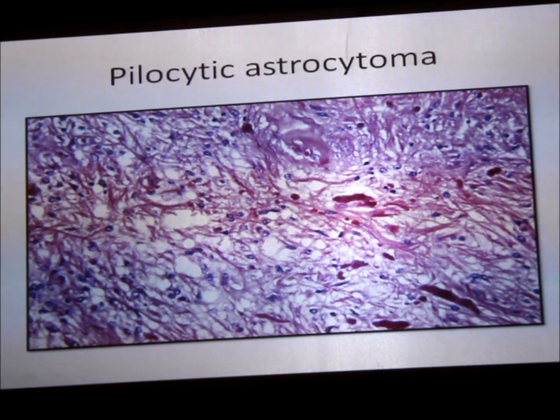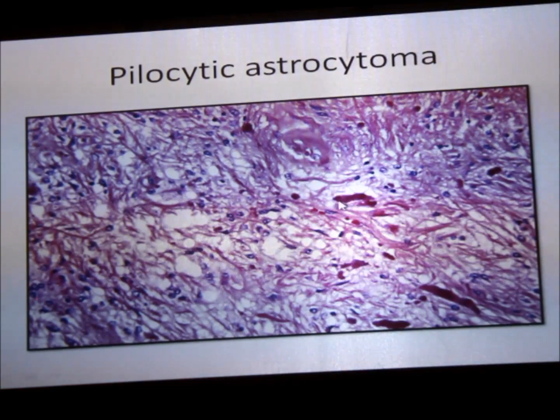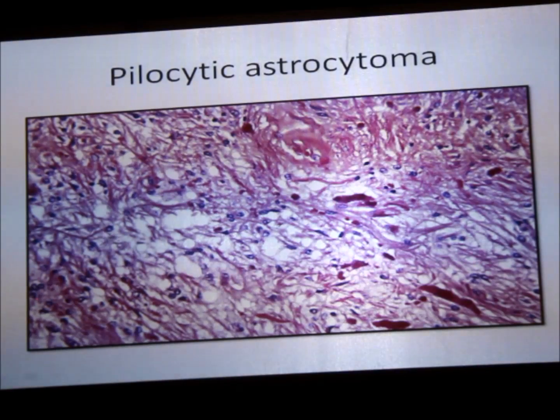Now another tumor arising from astrocytes where you see these fiber-like structures, pilocytic, okay, fibrillar, fibril-like structures, pili. So it is known as pilocytic. These thick fibers are known as Rosenthal fibers. Rosenthal fibers, all these, and these are piloid fibers, piloid structures. So these are all astrocytes from which you can see these fibers coming out. So this is another tumor of brain, astrocytoma, but it is pilocytic astrocytoma.